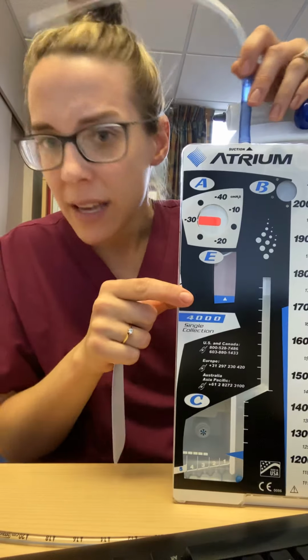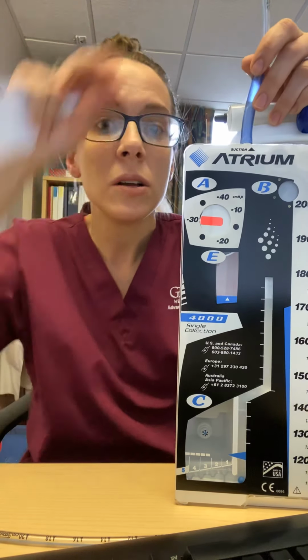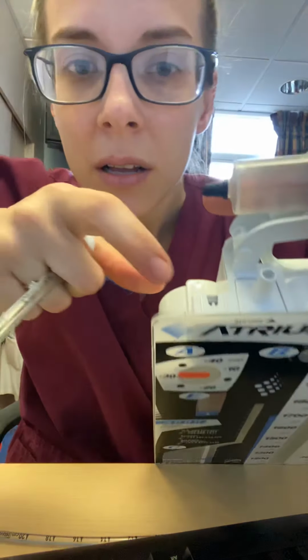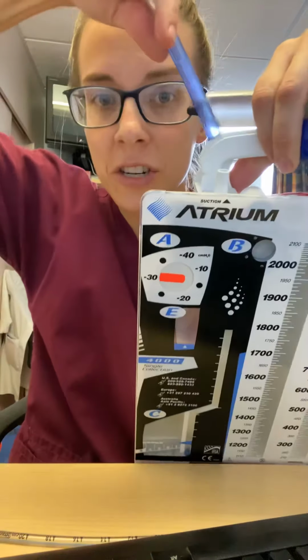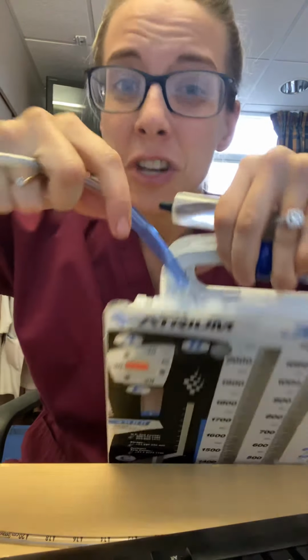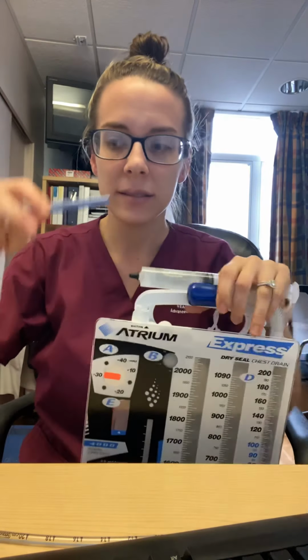So then let's say the surgeon comes by, says, oh, they're doing great. I don't need them on suction anymore. I'm good with water seal. All you do, pull it off of that little knobby here. Pull the suction tubing off. If the suction is on the wall and this tubing is on here, you might really have to yank it off to get the suction tubing off the top of this.